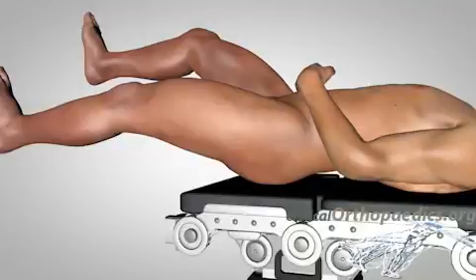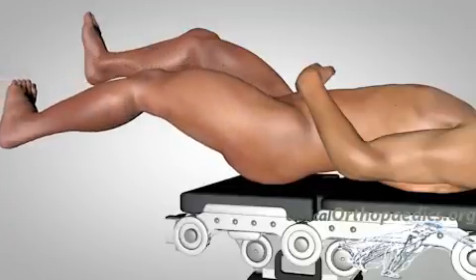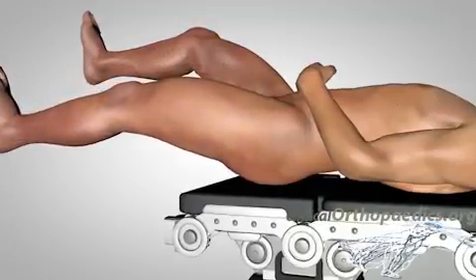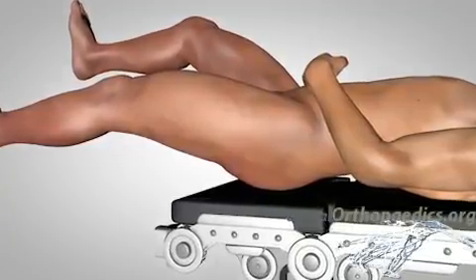Internal fixation involves fixation of the fracture using cancellous screws or pins. The patient is positioned supine on a fracture table, allowing distraction of the fracture. By pulling the leg in the direction of the long axis, if necessary, the position of the injured leg can be manipulated in order to achieve satisfactory reduction of the fracture.